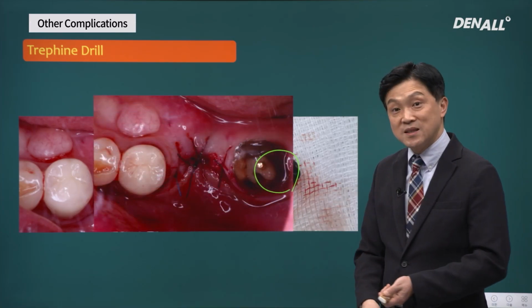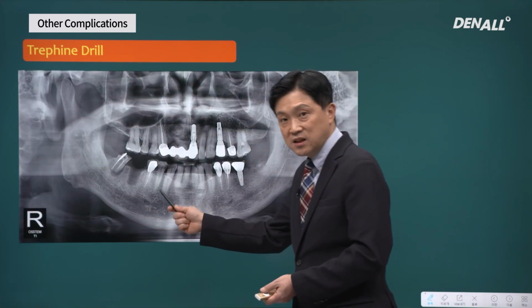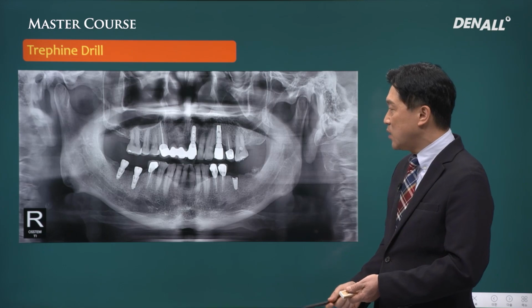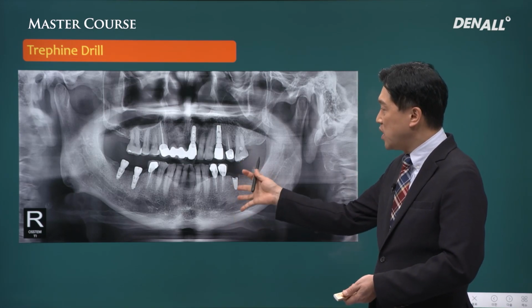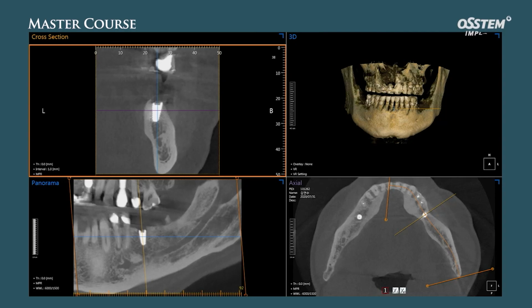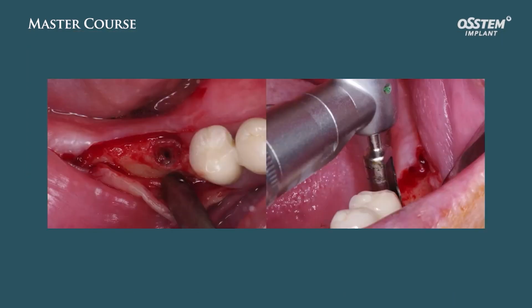This patient was referred to me, so I just did suture. You can see that in the post-op CT, the defect is quite significant. So I sent the patient back. An implant was placed again. If you look over here, fracture occurred once again. So it's been quite some time since fracture occurred.